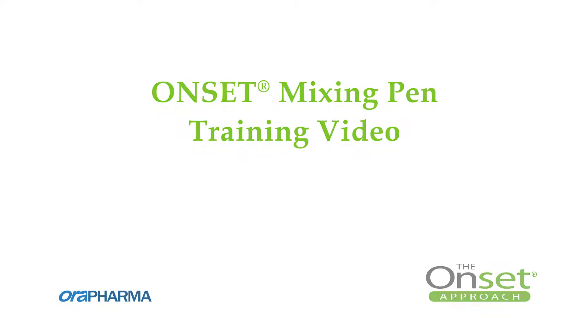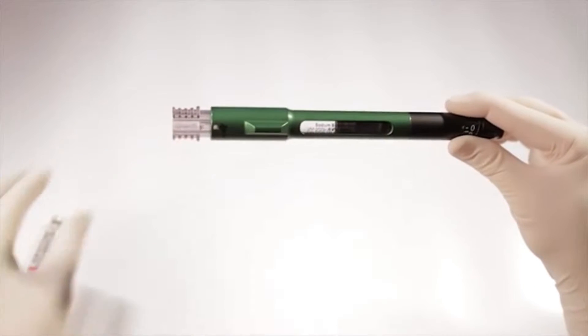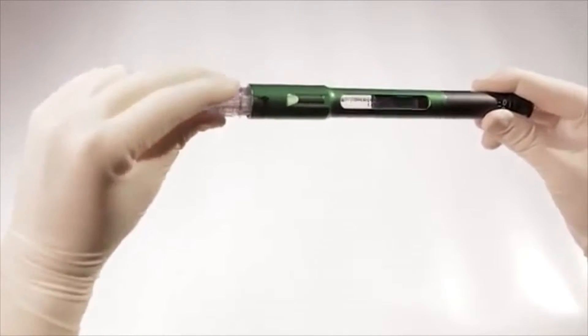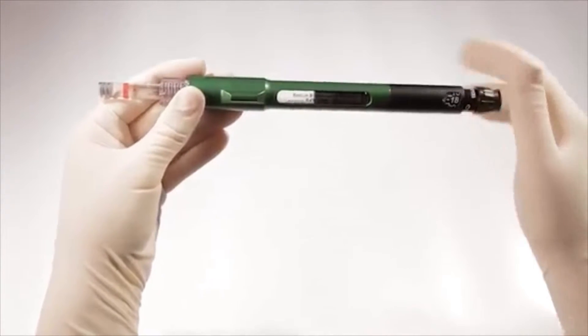This video will show you how to easily and precisely mix two parenteral solutions using OnPharma's mixing pen and cartridge connector. The mixing pen is easy to use and conveniently provides a method for clinicians to precisely and safely compound two parenteral solutions via a sterile fluid path.